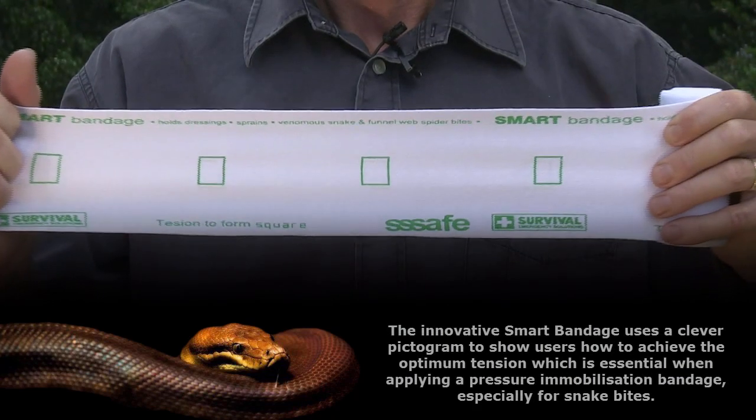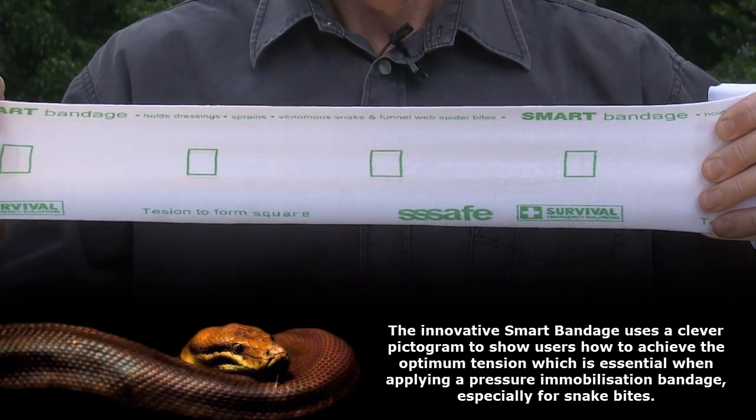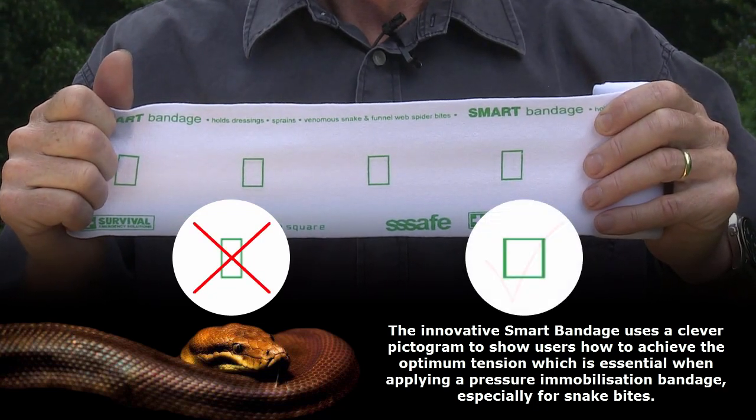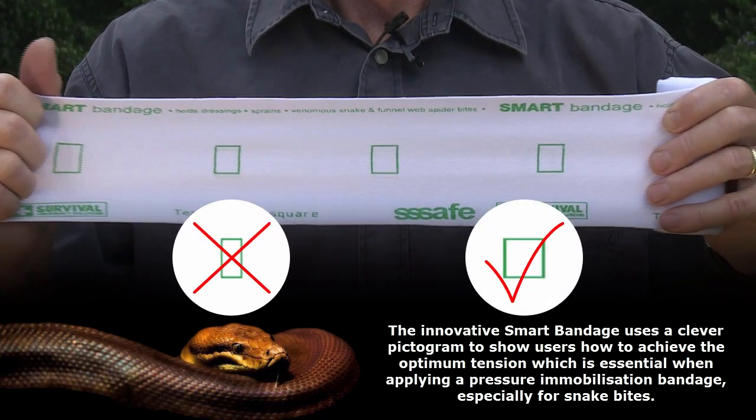The Innovative Smart Bandage uses a clever pictogram to show users how to achieve the optimum tension, which is essential when applying a pressure immobilization bandage, especially for snake bites.